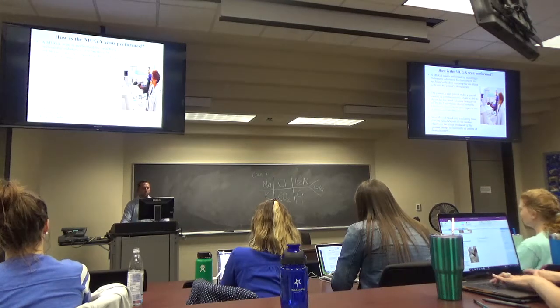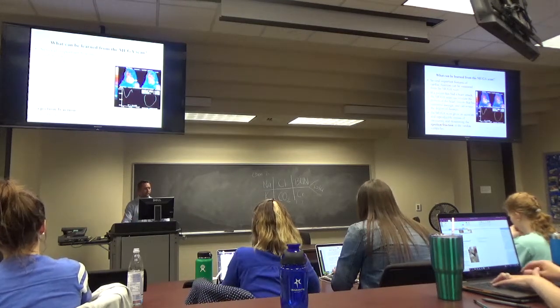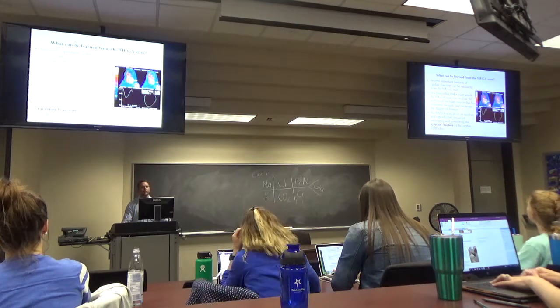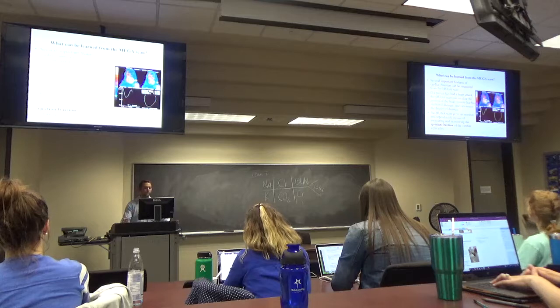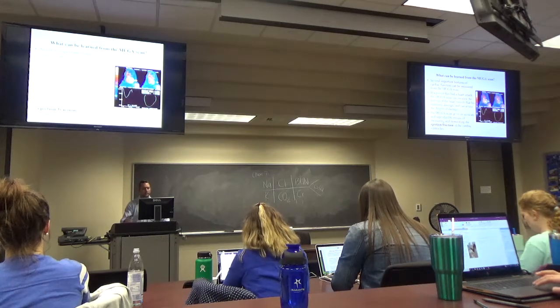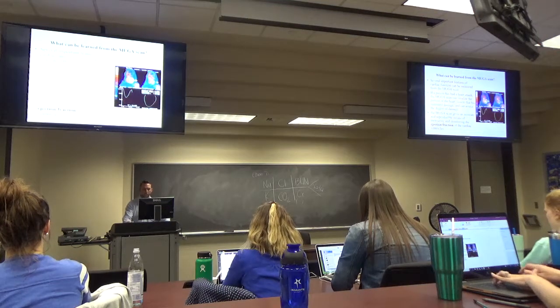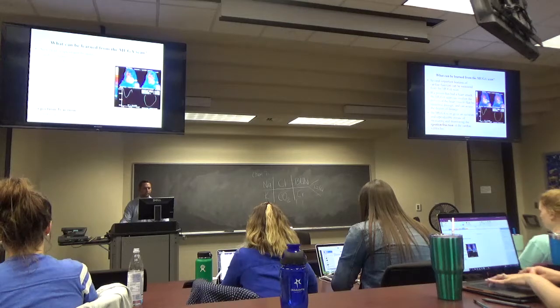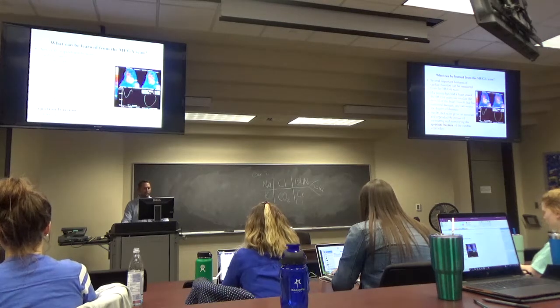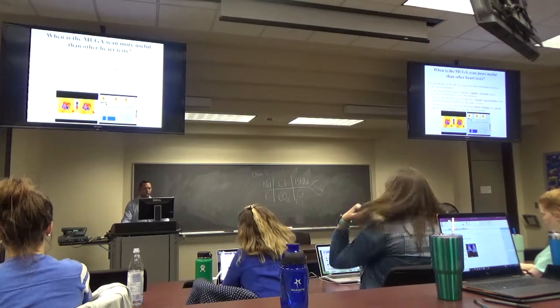We'll move on. But basically, this gives you a very precise ejection fraction, and it can also localize areas of previous heart attacks where you have heart muscle loss or damage. I don't know how to read these scans because we don't really use them anymore, especially at our facility, but I know they still use them at a lot of the cancer facilities, which we'll go into.